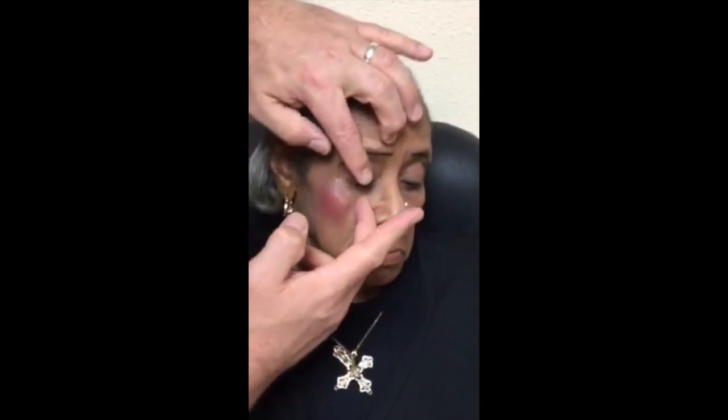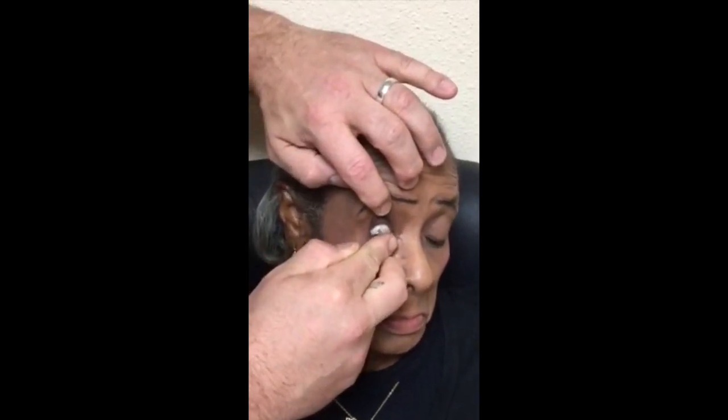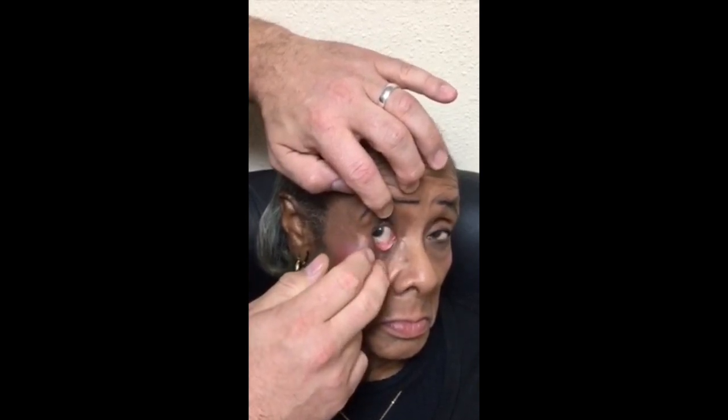Miss Howard is anesthetized. I have the patient look at the floor, raise her lid, place the bandage lens — look down, Miss Howard — place the lens on the eye, then look up. Close your eyes and keep them closed for me.